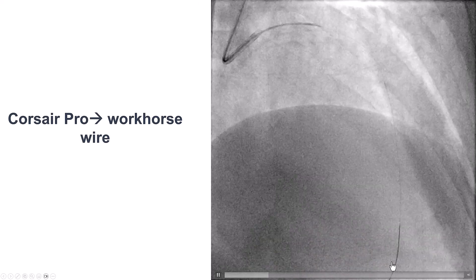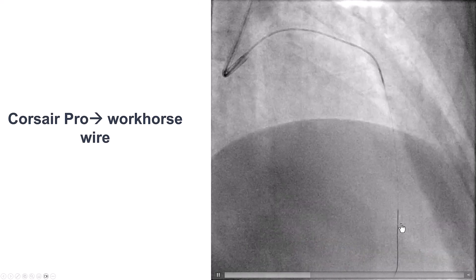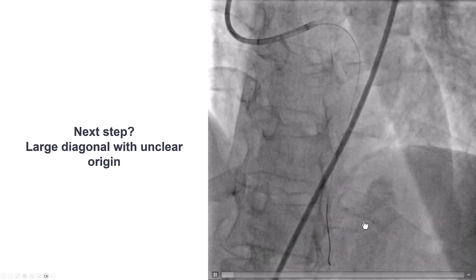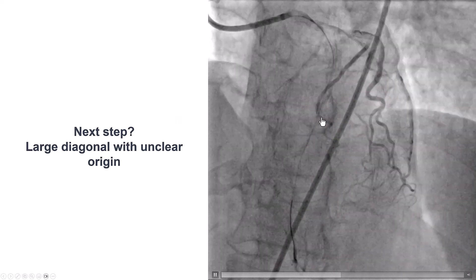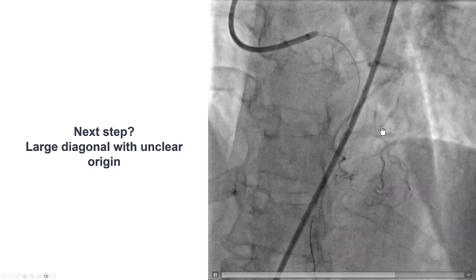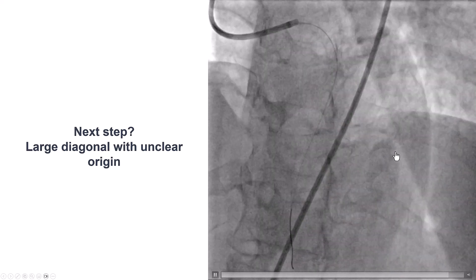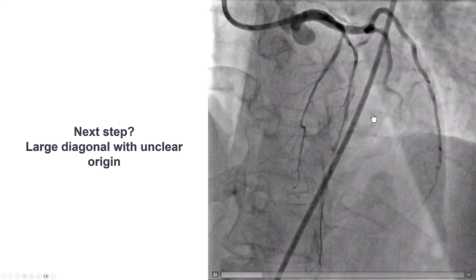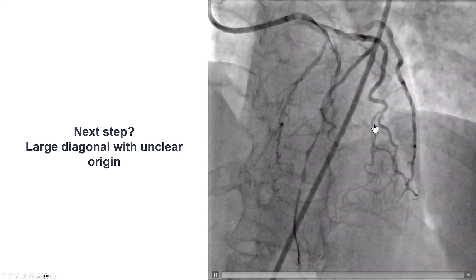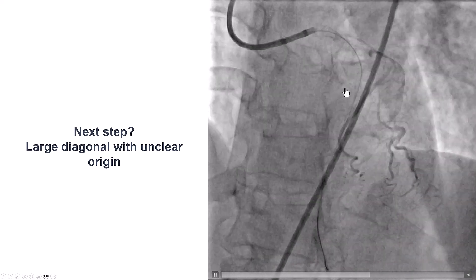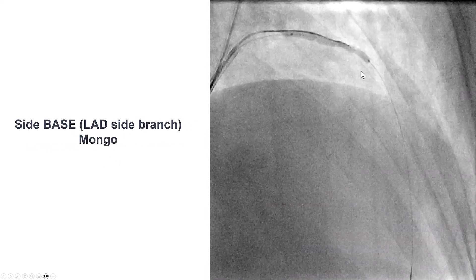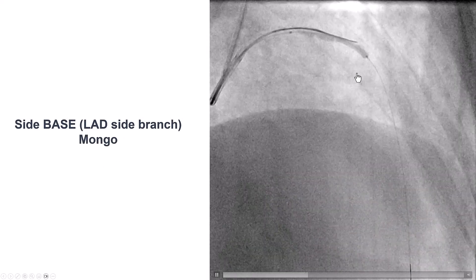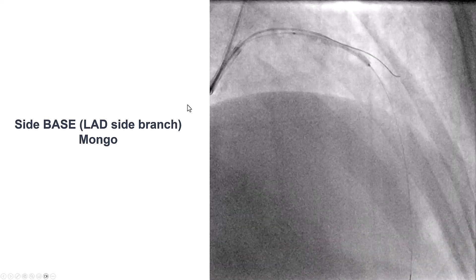We switched the Mongo for a workhorse wire over a Corsair, and now had some antegrade flow. However, the problem was that we did not have access to the fairly sizable diagonal branch, and we didn't really know where the diagonal originated from the LAD. We used IVUS but could not determine where the vessel starts. As a result, we decided to use the side-base technique.